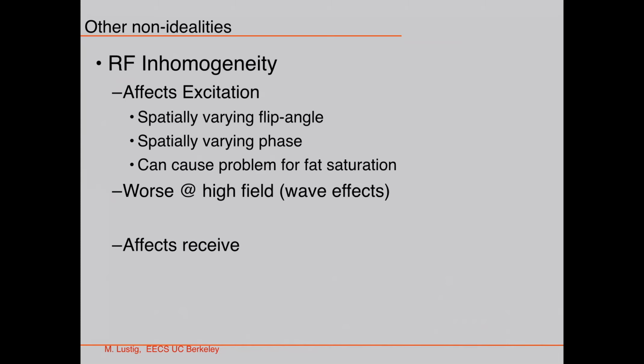I was thinking, a couple slides ago you showed the multiple slices and how you would line them up. I was just thinking like slice 1 and slice 3, you just have those going at the same time. Right, but then you would phasing code them exactly the same, and their signal will come up combined. Now, how do you separate slice 1 and slice 3 from each other? I'm not sure.